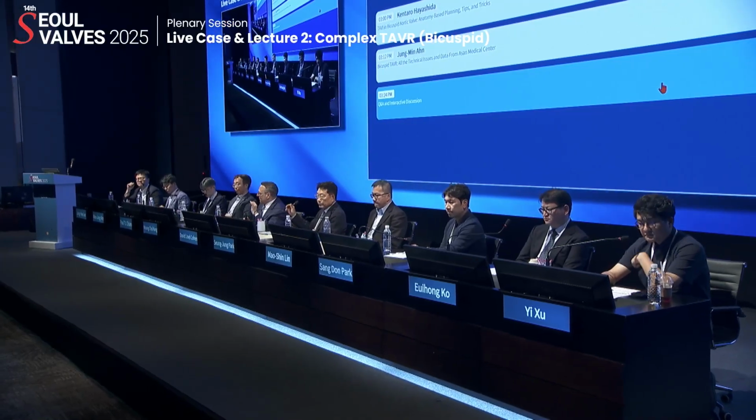Thank you very much, Dr. Ahn. So we have a few minutes for discussion on this. Are there questions from the panel or from the audience? Dr. Hayashida, in terms of symmetric expansion of TAV, it looks like the balloon expandable valve is better than self-expandable valve. So is there any personal guideline when you select the valve type in bicuspid aortic stenosis?